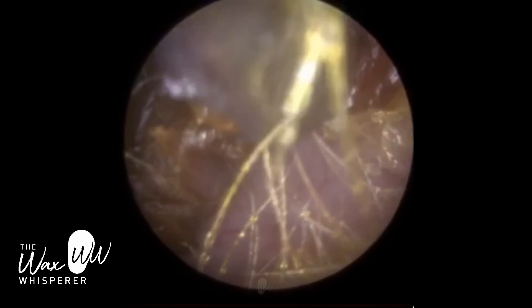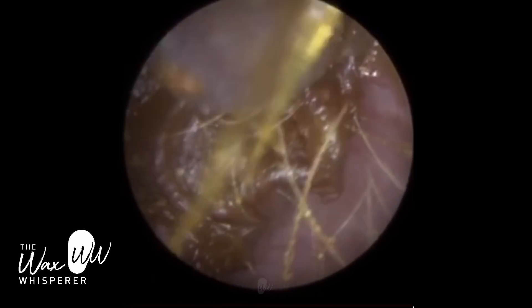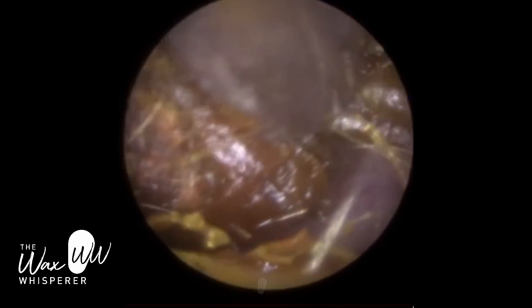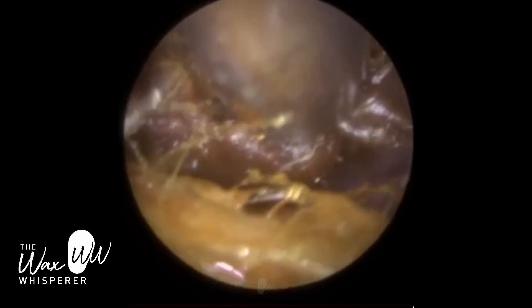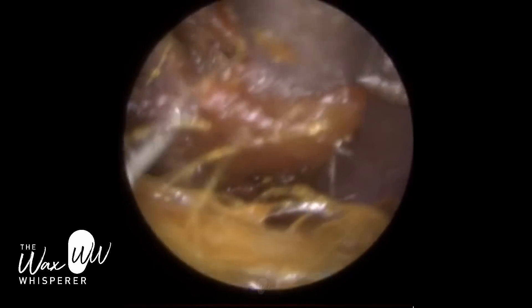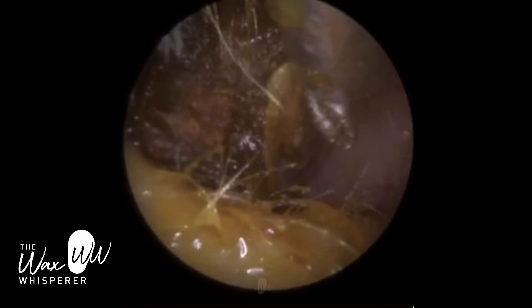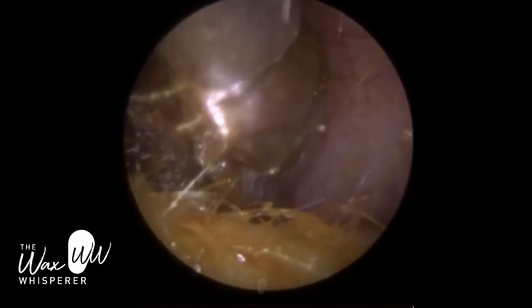I put some olive oil earwax drops in the patient's ears and let it soak for a few minutes. What the olive oil does is bind the wax together — it has a binding effect. However, you can see the drops didn't penetrate very deep in the ear, because the lateral bit of the earwax near the entrance is a complete seal. So although it softened the outer part of the earwax, the lateral piece, it didn't really penetrate very deep. Some drops did seep through, but not a lot.